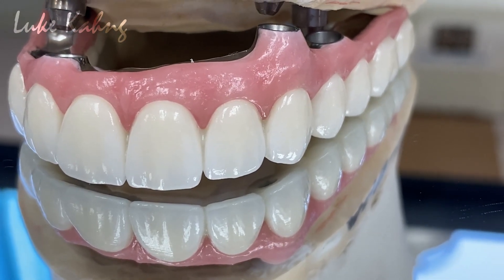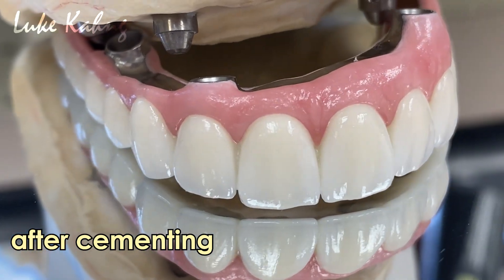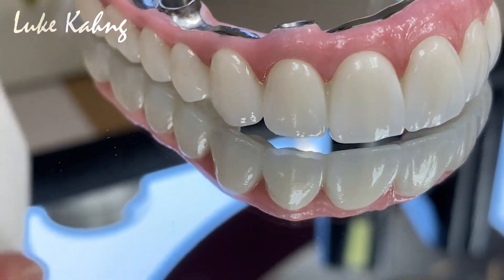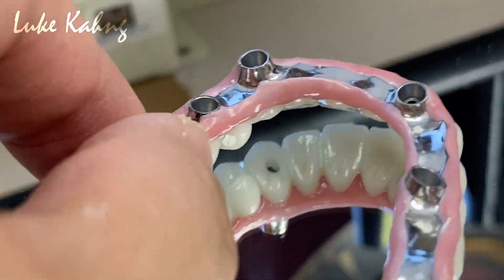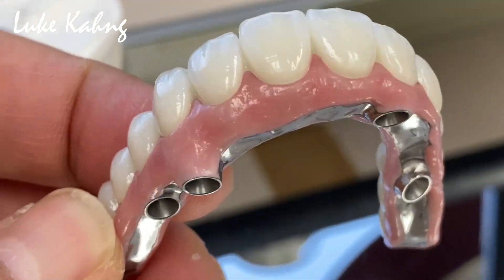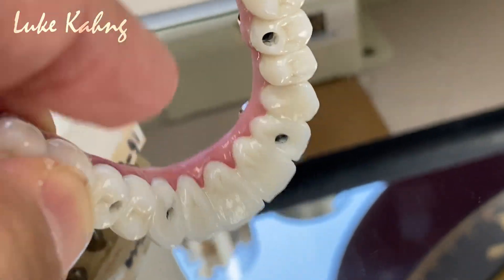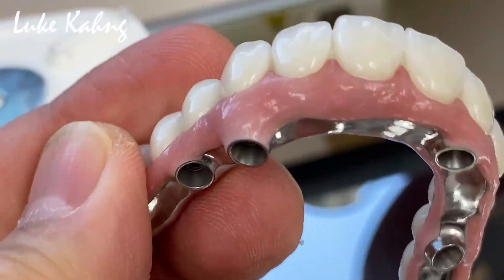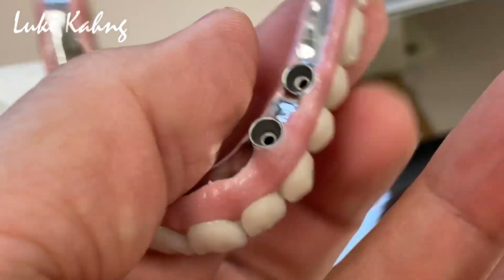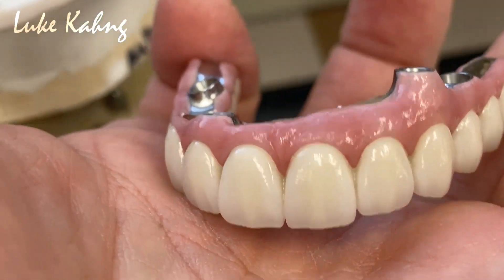This is after cementation. Cases like this show exceptional hygiene. The polish is great. We're going to the finals now — it's all one piece. We finish it. It's pretty light compared to solid zirconia, and we're done.